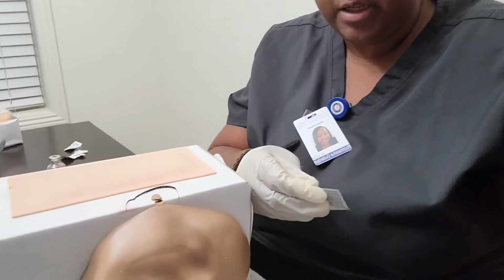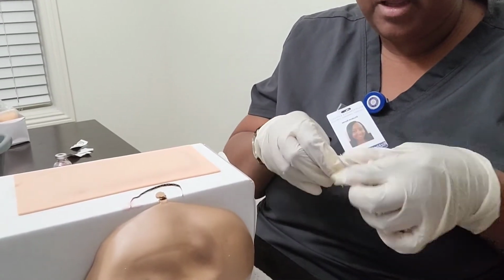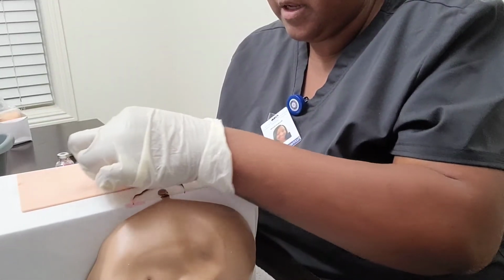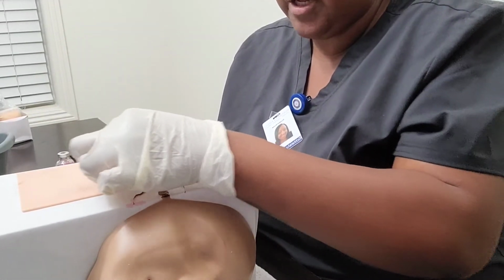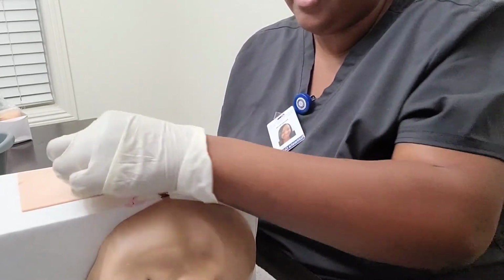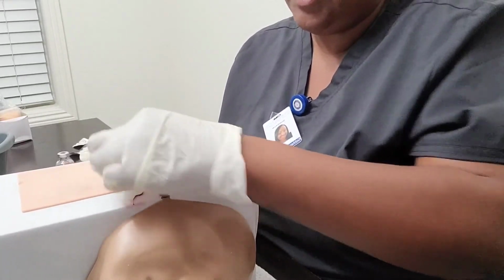Okay, so I will go ahead and take my alcohol wipe and I will start in the center, a small circular motion, and then I will go outer and outer.